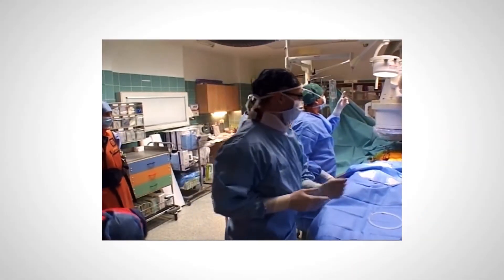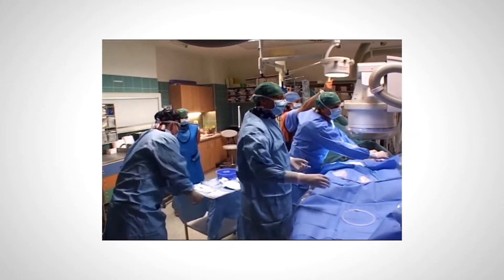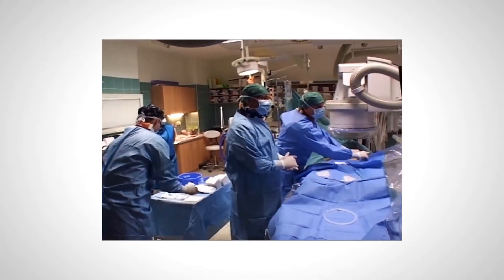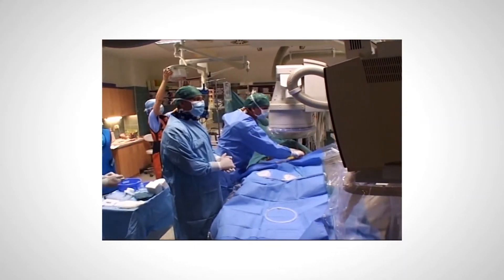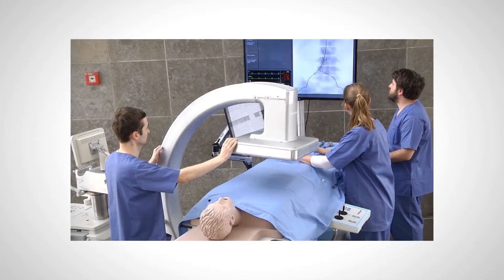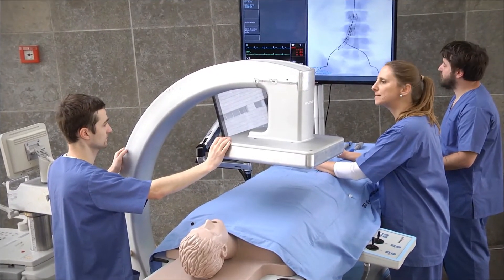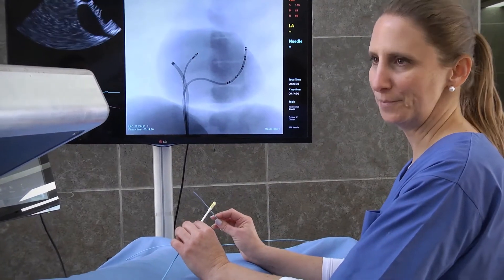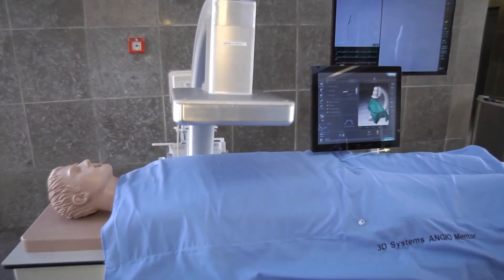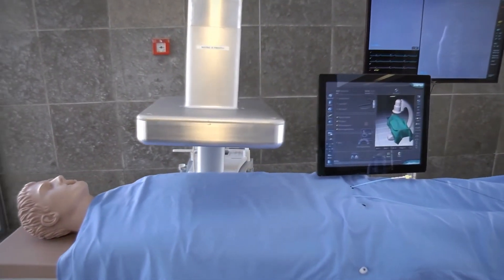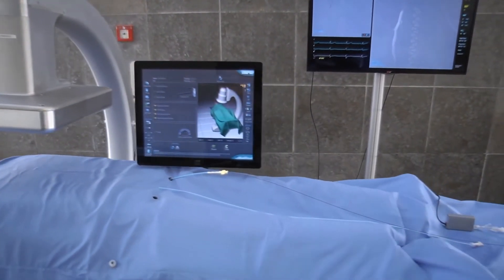Endovascular interventions require coordination and cooperation between team members, such as primary operator, second operator, surgical nurse, x-ray technician, and sometimes anesthesiologist. Angiomentor Suite Simulator is ideal for enhancing team communication skills while training on endovascular interventions. The Angiomentor Suite human-sized patient mannequin allows multiple team members to stand around the patient as in real life and practice team communication.